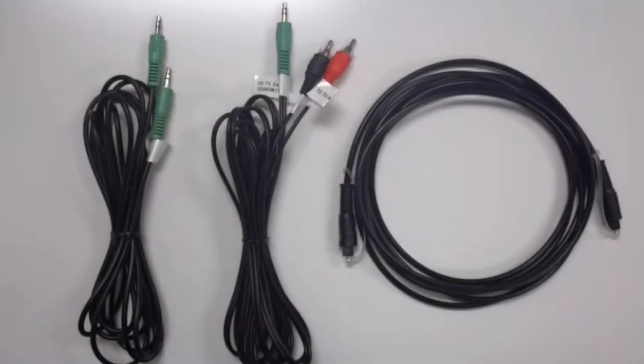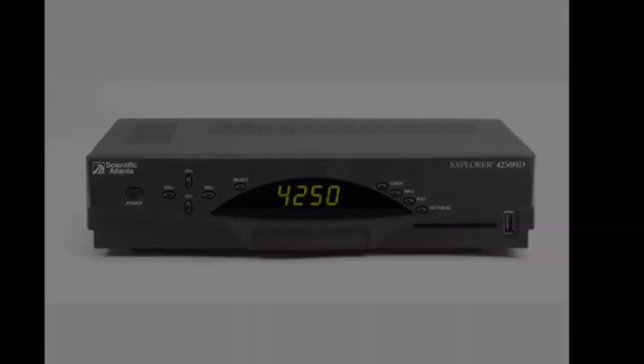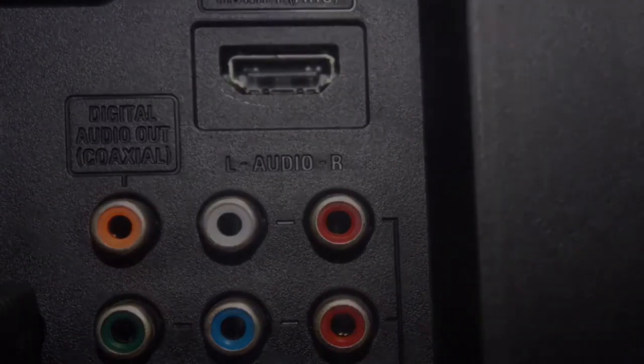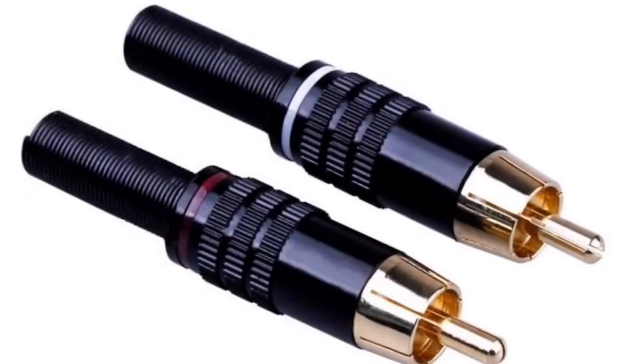Finally, if none of the included audio cords are an option, you may need a different cord entirely. If your television, cable box, or satellite box only has a circular port labeled as digital audio out or coaxial, and none of the other cords can connect, you will need a coaxial audio cord, which is not included. It may be purchased from most electronics stores.